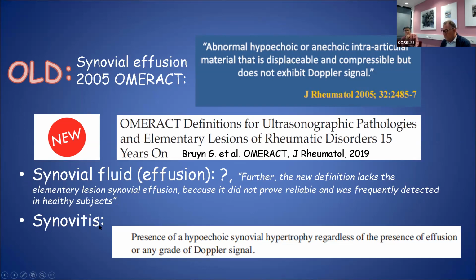However, they also define synovitis as the presence of hypoechoic synovial hypertrophy, regardless of the presence of effusion or any grade of Doppler signal. So Doppler can be part of synovitis, but synovitis is defined also without Doppler.